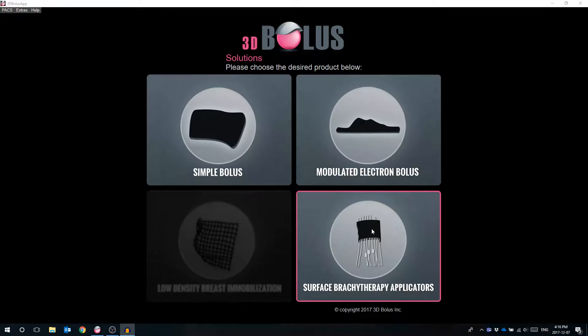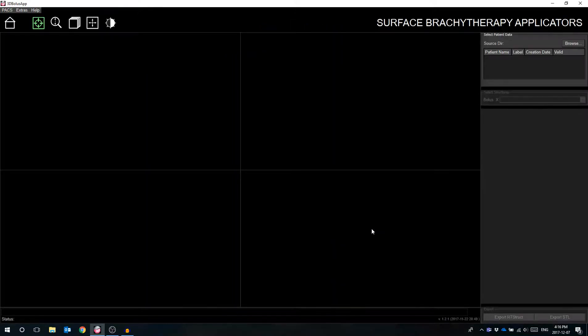Today we will be taking you through our HDR Surface Brachytherapy module. To create a surface applicator, the user begins by selecting the appropriate module from the 3D Bolus home screen.